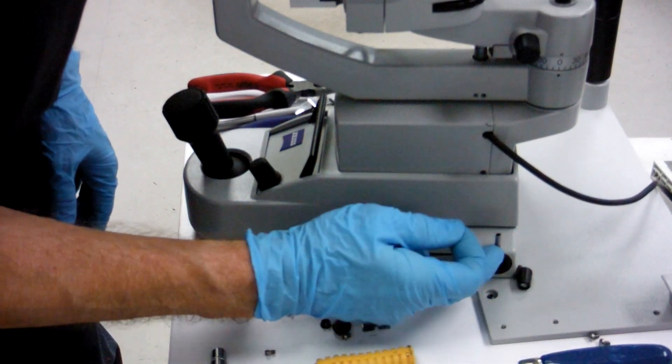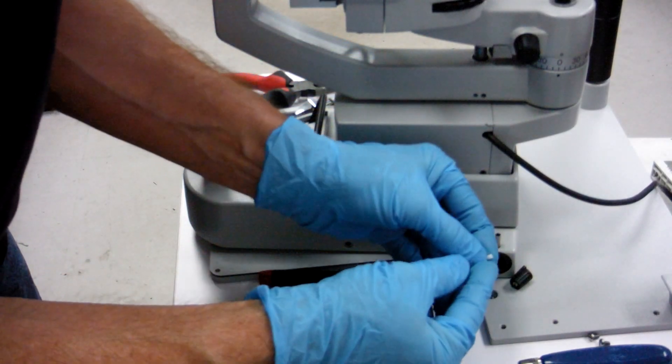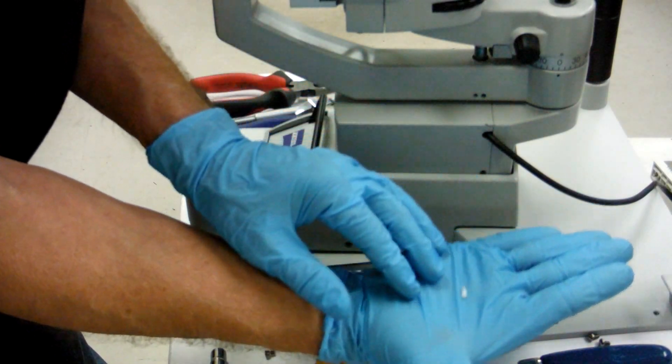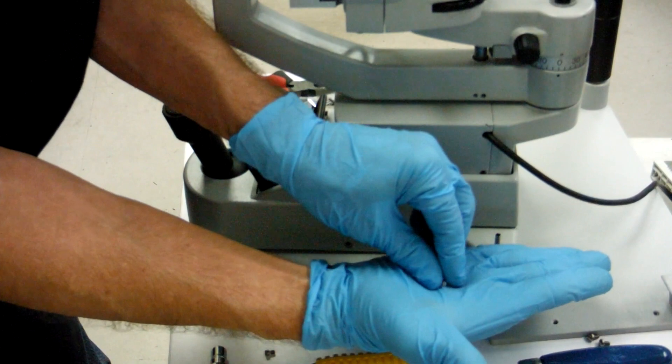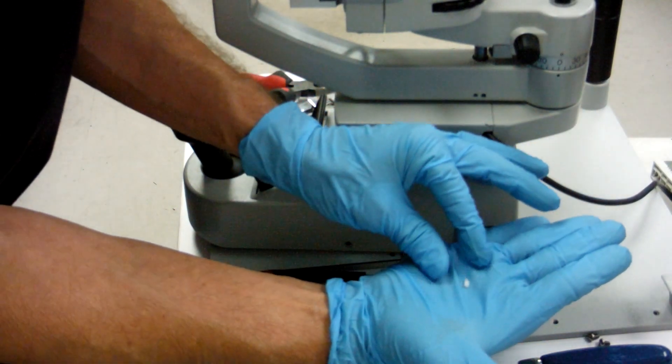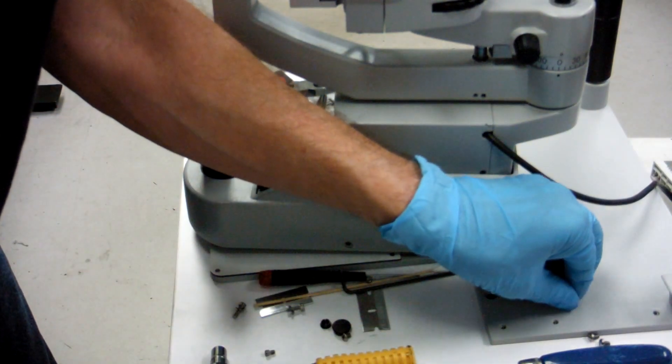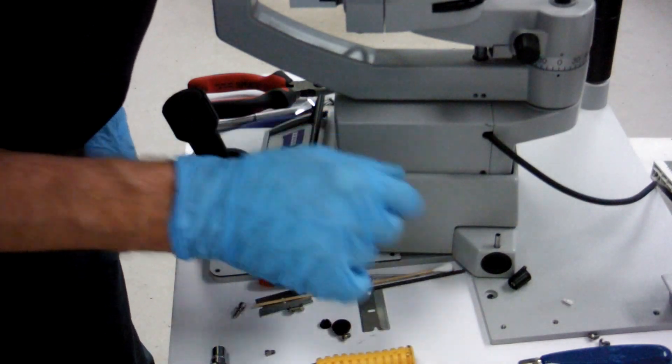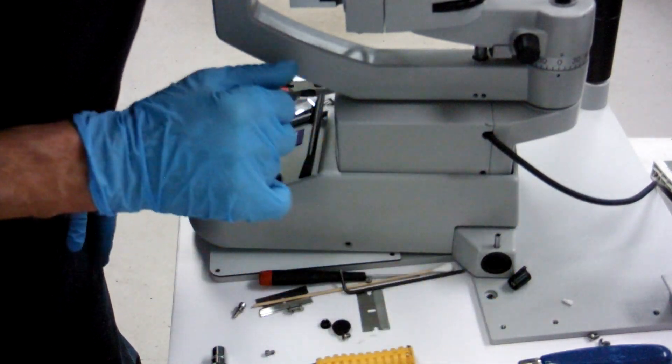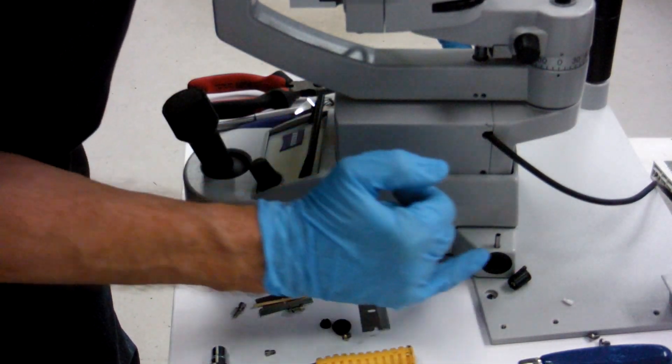In this locking mechanism, you have your knob, you have a spring, and then you have a little plunger pin that may wear out.